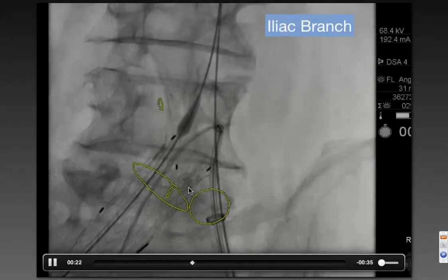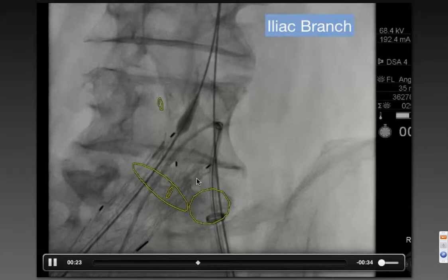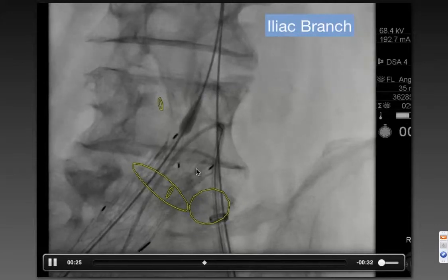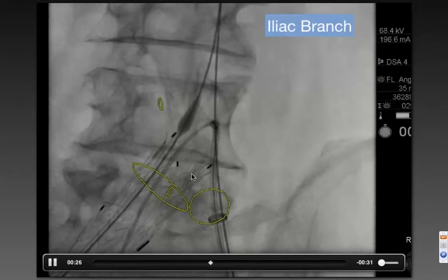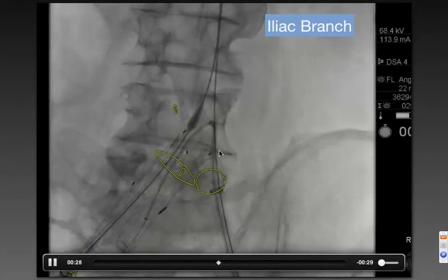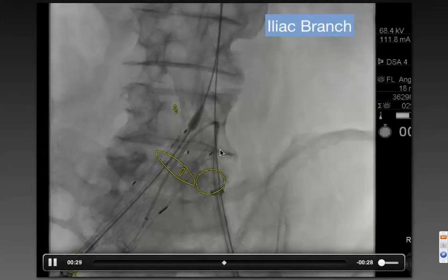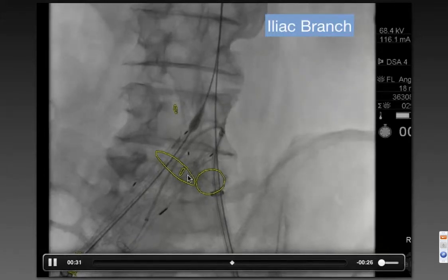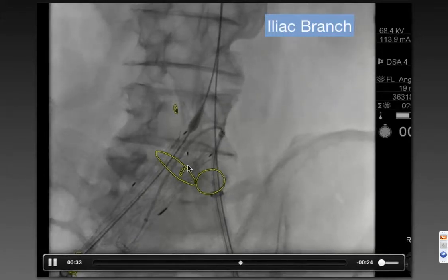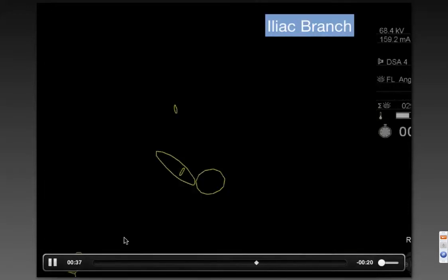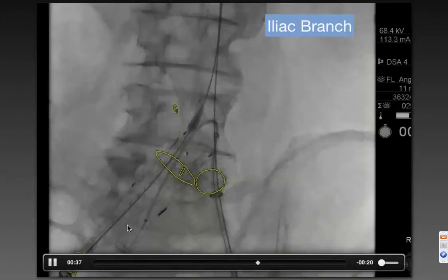We've made this very challenging for ourselves because the endograft is sitting proud of the bifurcation. So you've got to come up out of the origin of the left common and start working up and over the top of the endograft and then catheterize that little limb that's down there.